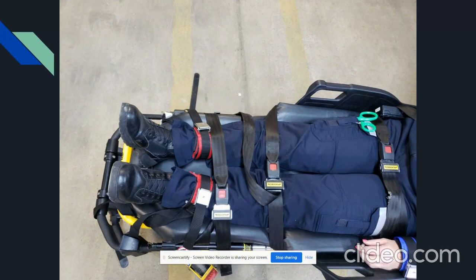Here is a picture of the restraints being on the ankles. They're very secure. She can't lift her leg up. As you notice, the seatbelts are on as well. So you do the restraints as well as the seatbelts to make sure that patient is secured.